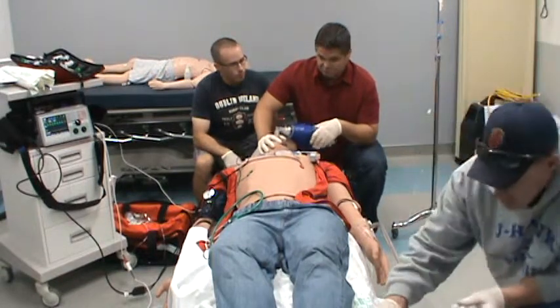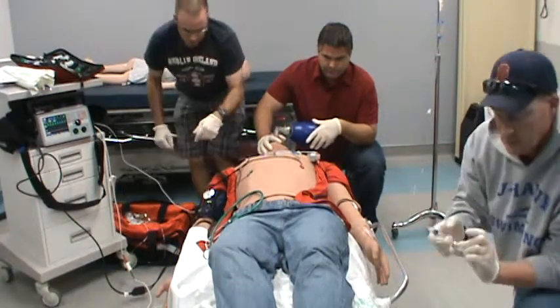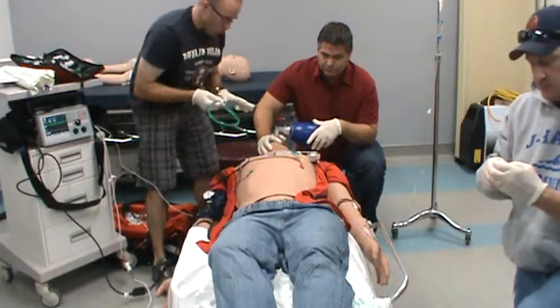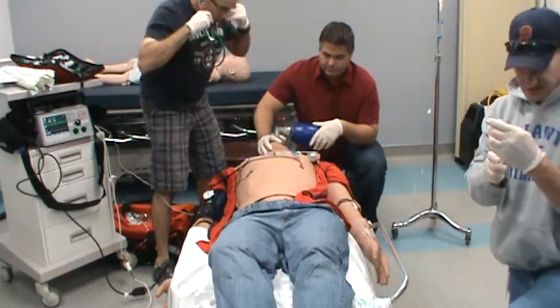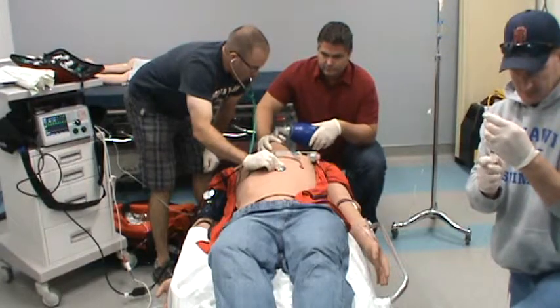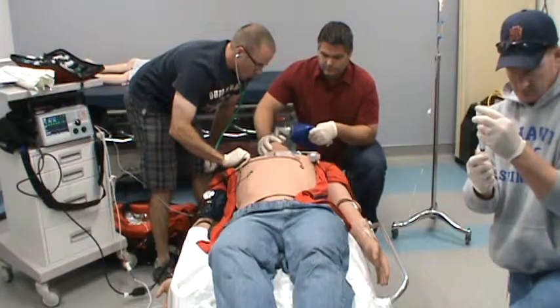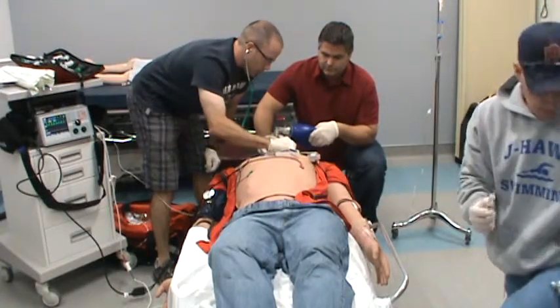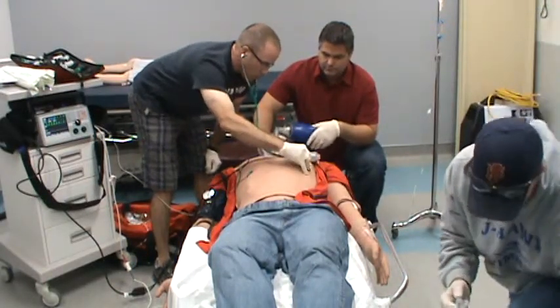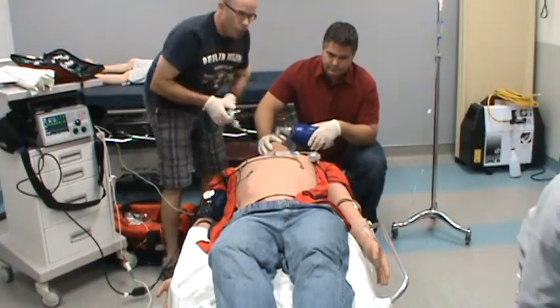How's the bagging going? Still easy to bag. Okay. I know we already took a listen, but while you're doing that, I'm just gonna... Okay, that's good. I'm not hearing anything in the stomach. Okay. That sounds good so far.